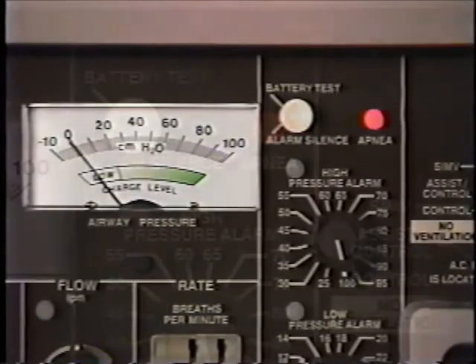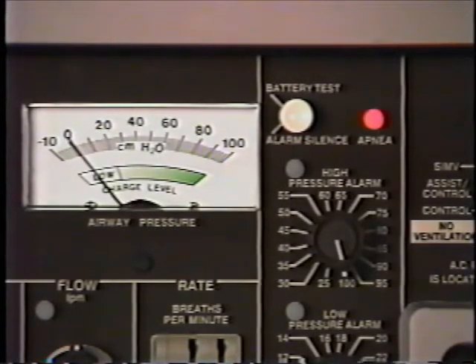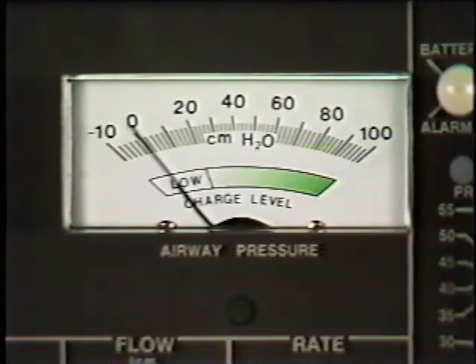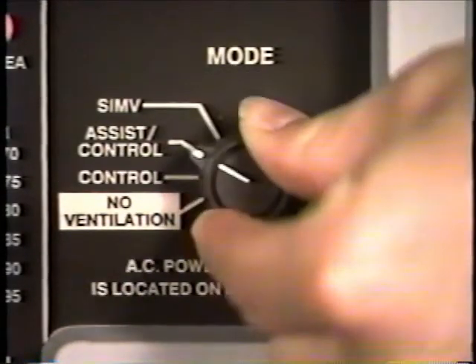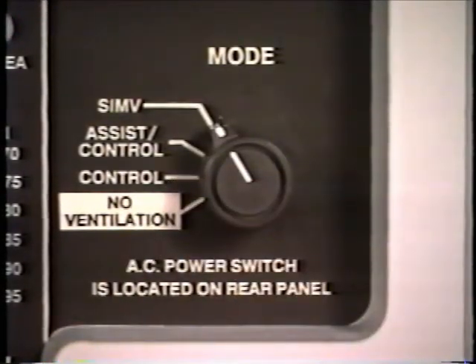During backup ventilation, the apnea alarm will continue to sound until either one of two conditions occur. First, if the patient initiates 2 breath efforts within a 10-second period, the apnea alarm will automatically be silenced, and the Companion 2801 will automatically transfer from backup to the SIMV mode. Second, by rotating the mode control out of and then back to the SIMV mode. This will be followed by initialization, and the Companion 2801 will function in the SIMV mode.